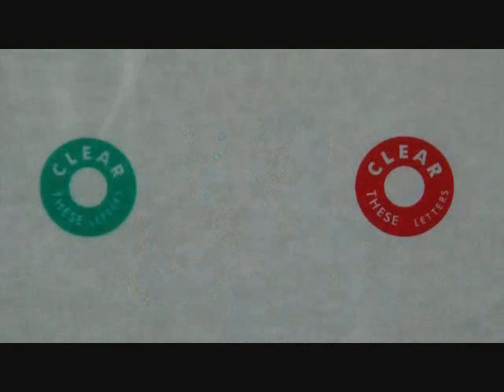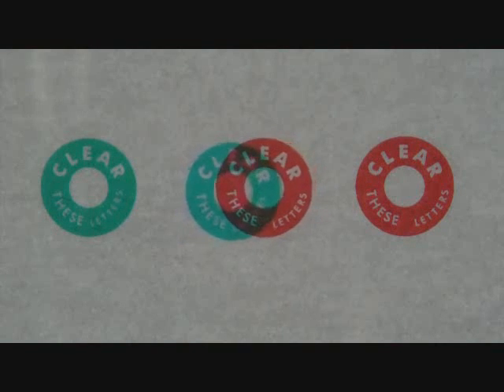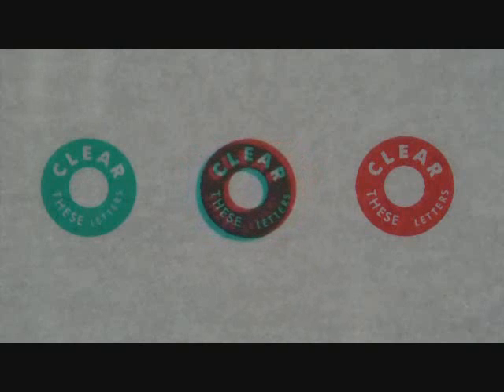As you move the pencil away from you, you should notice two circles at first, then four, then three, with the middle one being a mixture of the red and green colors. You want the middle circle to float away from you with all the letters being present. It should read, clear these letters.